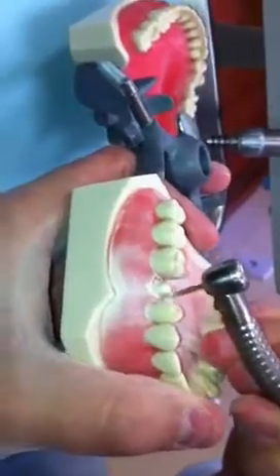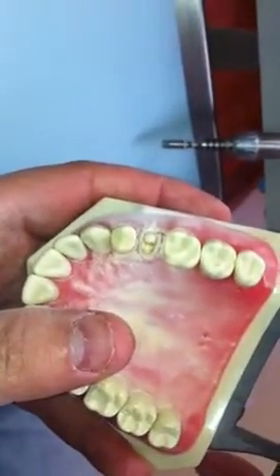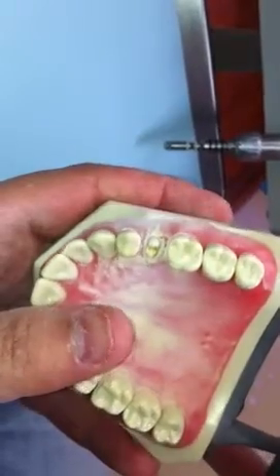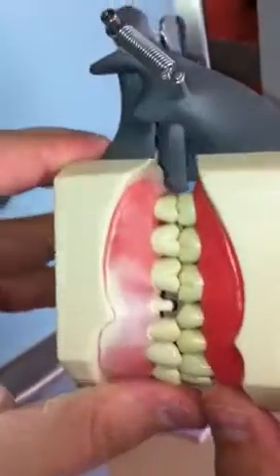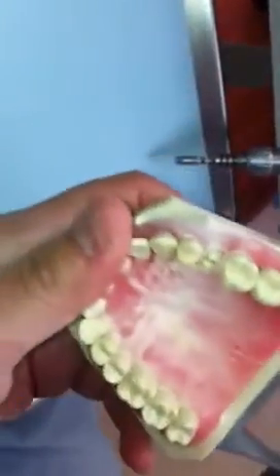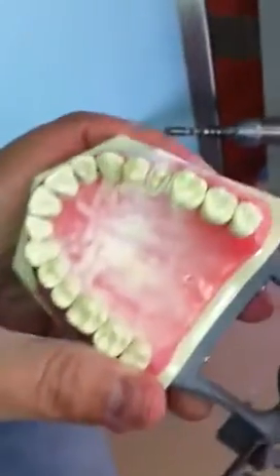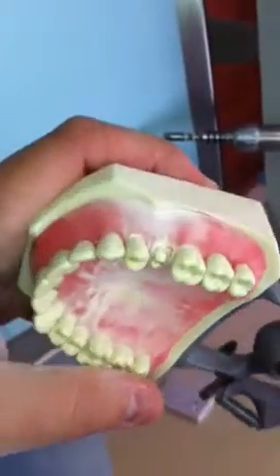There we go — one millimeter margins all around, two millimeters occlusal clearance. We go from the chamfer prep to a shoulder prep.